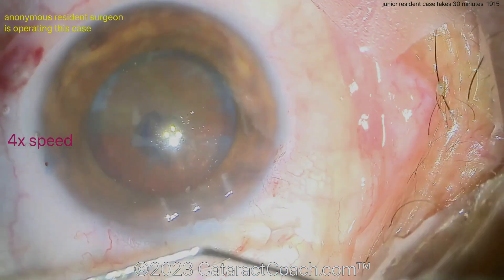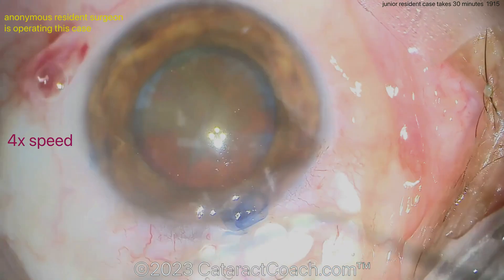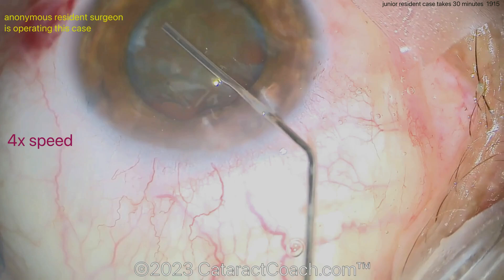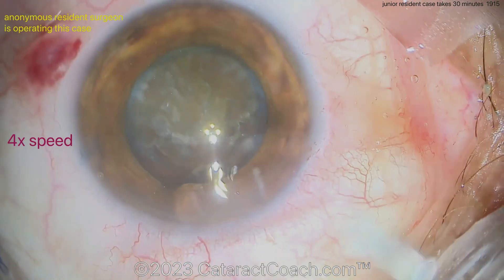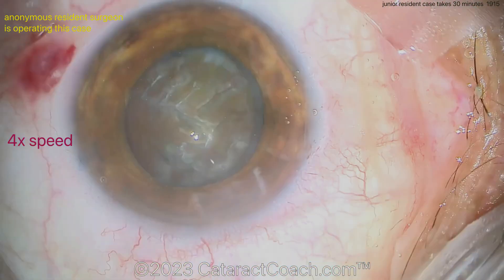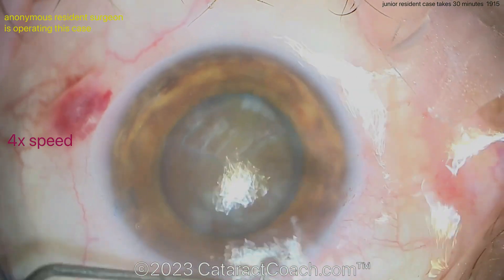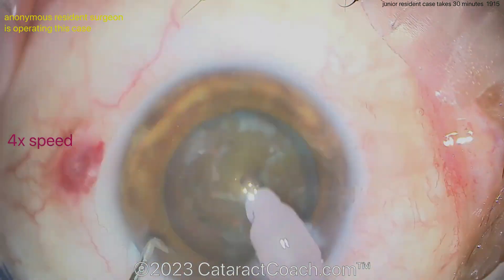Now it looks like burping out some viscoelastic — incision looks good, you can see the stromal markings. Now a little bit of hydrodissection being done. We've sped the video up since the case is about 30 minutes long, condensed to about seven minutes. Still looks good — good rotation, so far so good. My suggestion at this point is to stop grabbing the conjunctiva so you don't cause that subconjunctival hemorrhage. Otherwise you're doing a great job — I like your incisions and your rhexis.